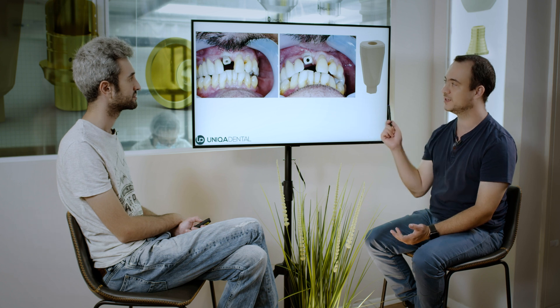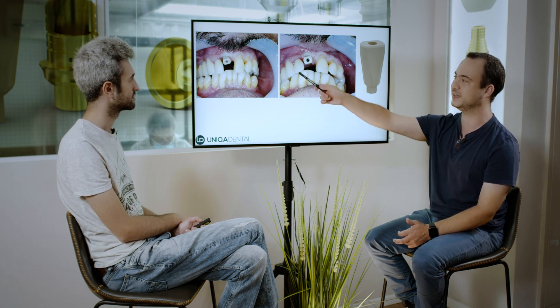This case is probably the ideal case for the restoration to learn how to use the intraoral scanner because you have all the teeth and you have only one scan abutment. You can scan it quite easily. You won't have any interference between the teeth and the scan abutment. In many cases, when you have only one implant and approximation between this implant and the tooth, you'll have a problem with the scan abutment because it won't fit — it would touch the tooth and if it touches the tooth, you're not sure the impression is accurate. Maybe you'll have inclination of the scan abutment. So you take off some material from the scan abutment. In this case, it is not the case — it is perfect for first-time users with intraoral scanners.